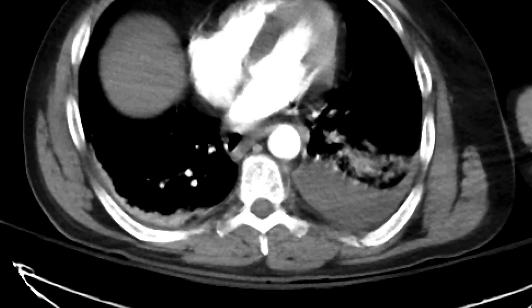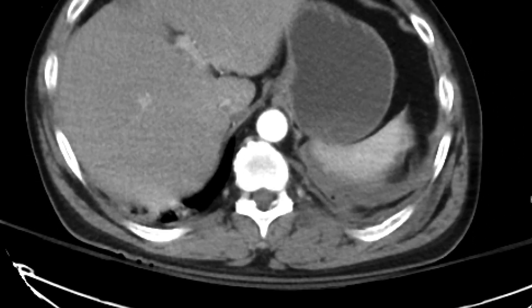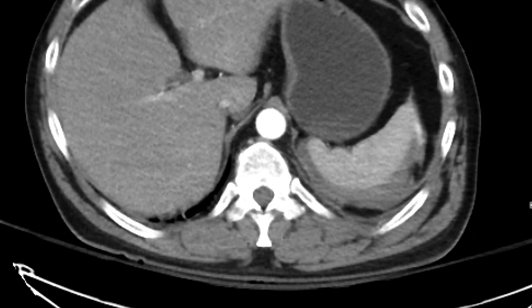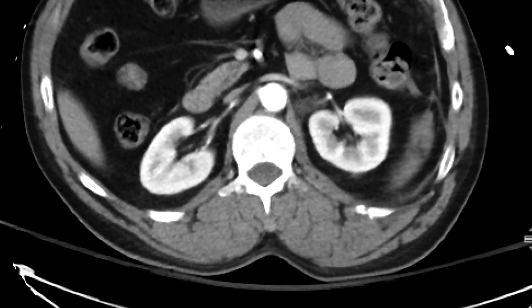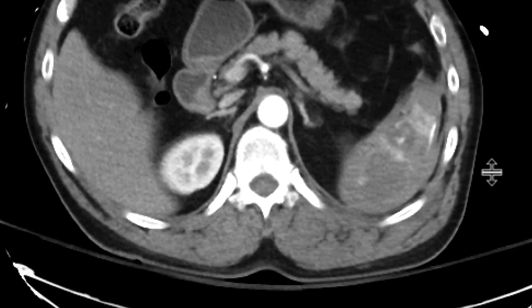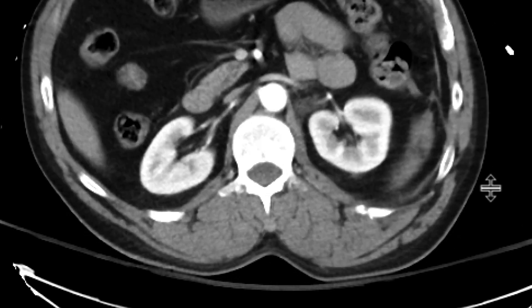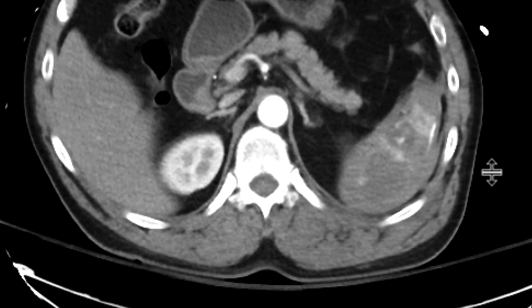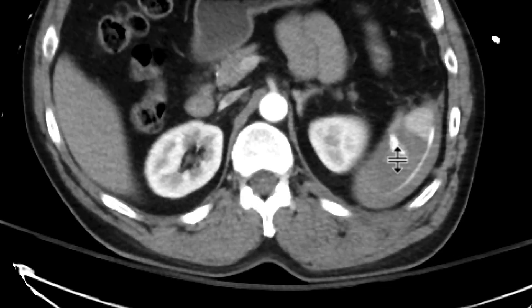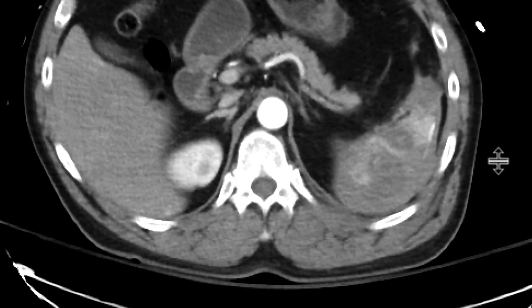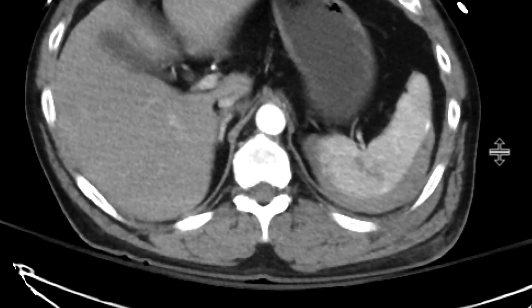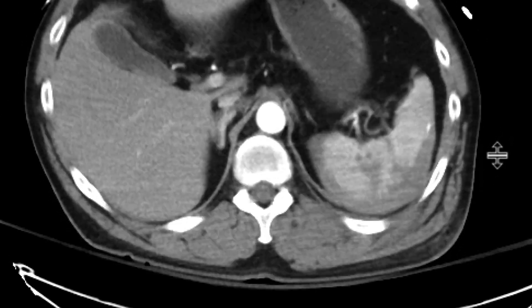There's also a left-sided pleural effusion. As we scroll down to the abdomen, we can see that there is a significant injury to the spleen with a laceration that's devascularizing much of the spleen, particularly in its lower pole. This is associated with contrast pooling and areas of contrast extravasation, findings compatible with a splenic laceration with contrast extravasation.